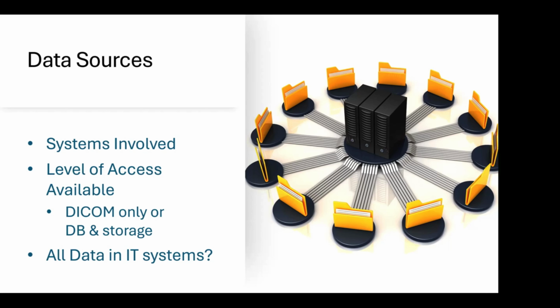These days, a lot of the legacy imaging data is stored in managed IT systems like a PACS or VNA, but you may get asked, and it's worthwhile determining if any of the imaging records are outside of those systems. For example, imaging records on file systems that have no application managing them or database to index, or even portable media like USB drives that may have come from some ancillary department mini PACS, but has not been migrated into the legacy PACS, but there is value or a desire to bring those into the system.